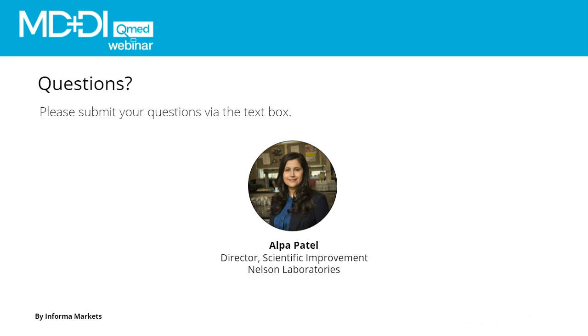Okay, good. Here's a new question. What are the 3 positive device controls as opposed to the previous requirement of 1? In other words, how do you obtain them? The positive controls validate that the extraction method you used is adequate, and that you did remove enough. And 3 is historically known as a number that's used for reproducibility. 1 only gives you that, at that moment, this is what we got, but 3 gives you reproducibility of the extraction method, that you were able to remove whatever there was on the device.